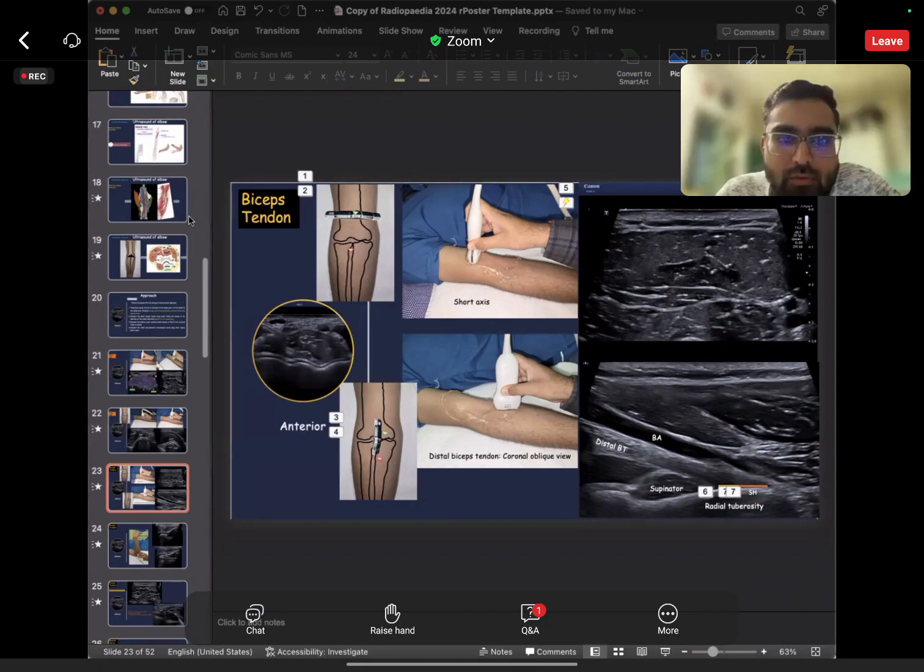The report template we are using is the European guideline, that is the European Society of Musculoskeletal Radiology. You just Google it and you will get the entire PDF of this normal protocol, and you can make your own protocol. There is nothing big in the protocols. Someone is asking for help with nerve compression syndromes, imaging features. You depend upon the rate of positive findings. Again, this is basic anatomy. We'll have another talk on the pathology also.